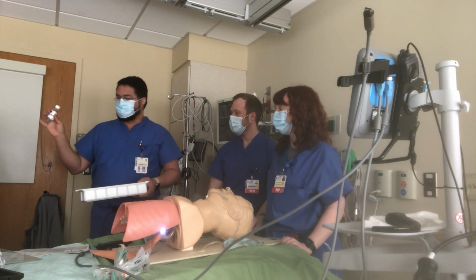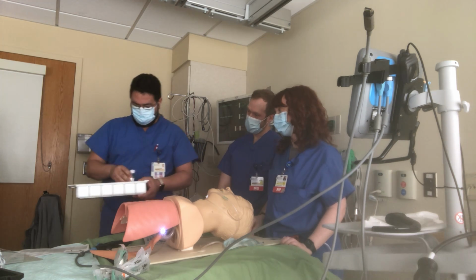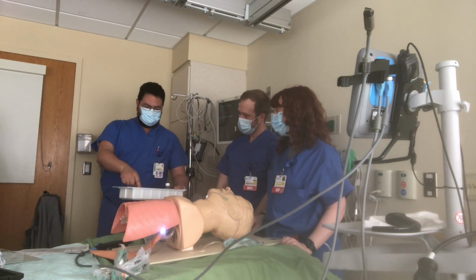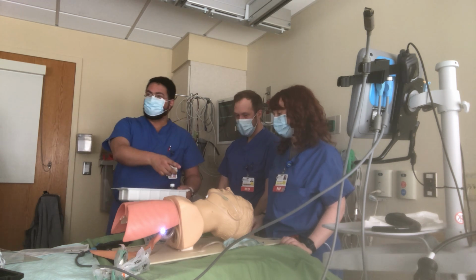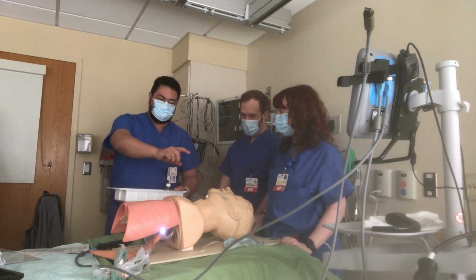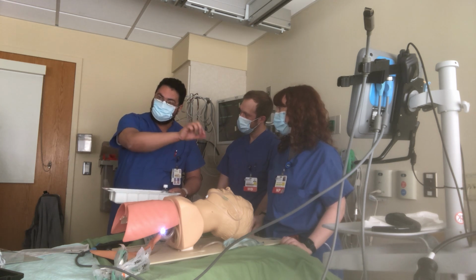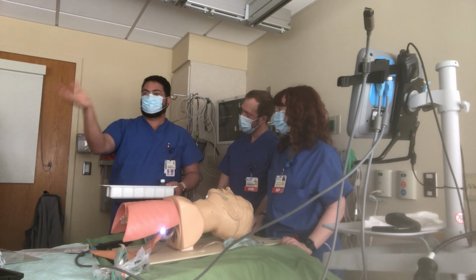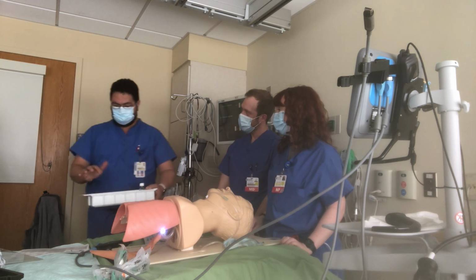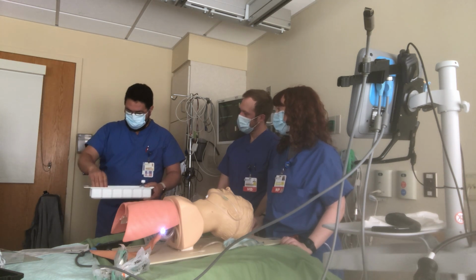So for the 4%, we're gonna ask respiratory to come and give us the big neb and put this in it. That's the 4%. Cetacaine spray, this one here. And where are you gonna spray? You start with the tip of the tongue, and then the most important ones are the 2 tonsillar pillars on both sides. It has a straw attached to it. Right? What's next?